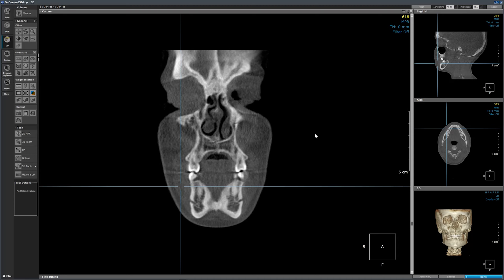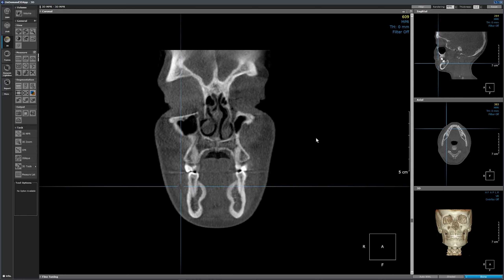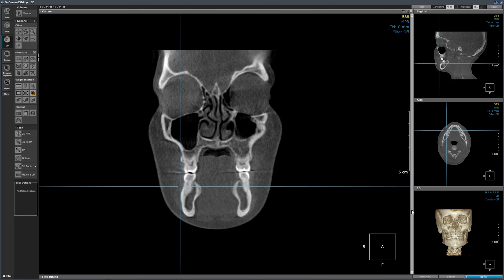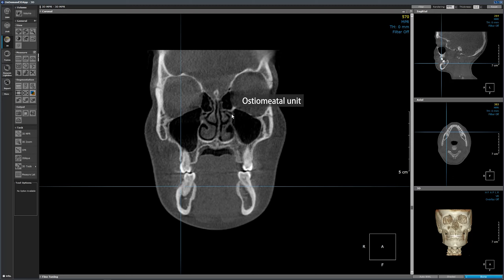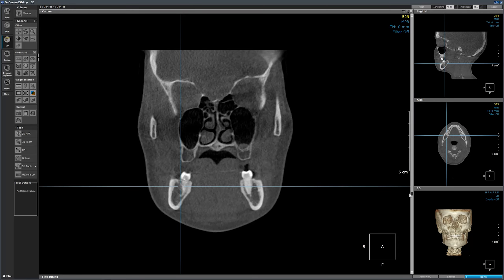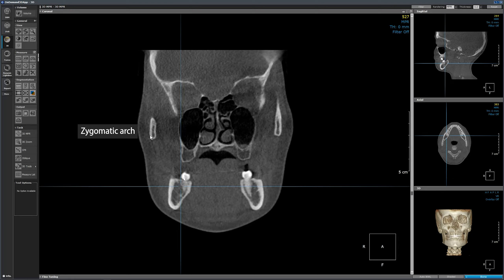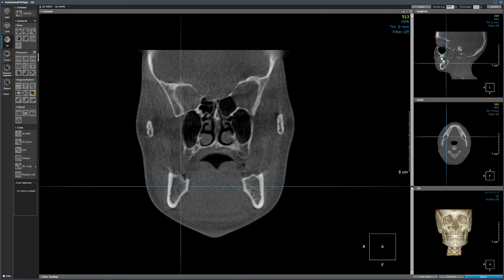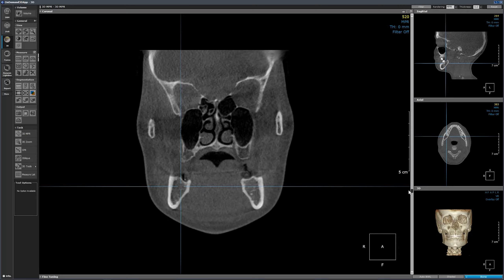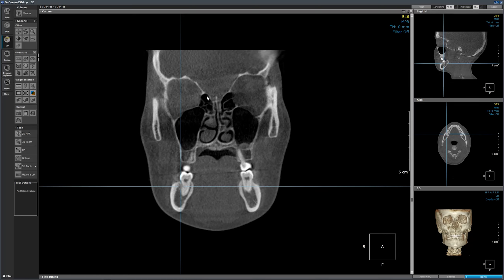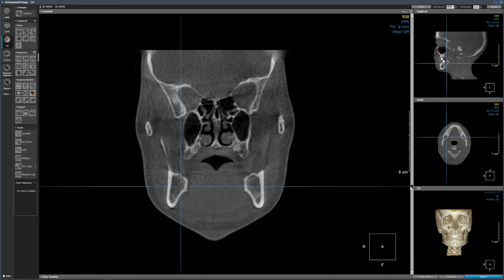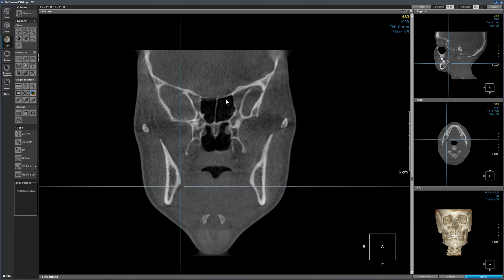Coming back anteriorly, let me show you another landmark — this is the mental foramen. Going back distally, this narrow passage is called the ostiomeatal unit, which is the drainage path of the maxillary sinuses. We have also started picking up the zygomatic arch. Coming anteriorly again, I'll show you a few more structures — these are the ethmoid air cells. Continuing distally, here we picked up the sphenoid sinus.